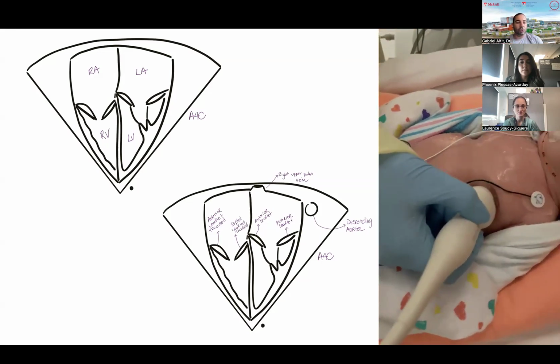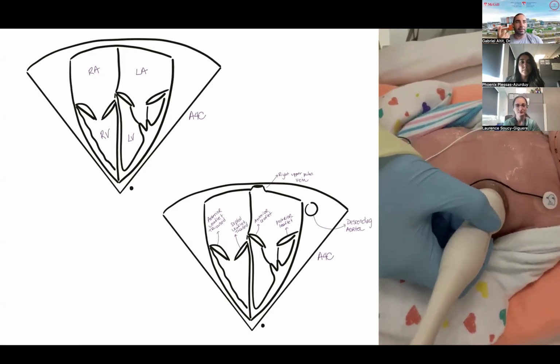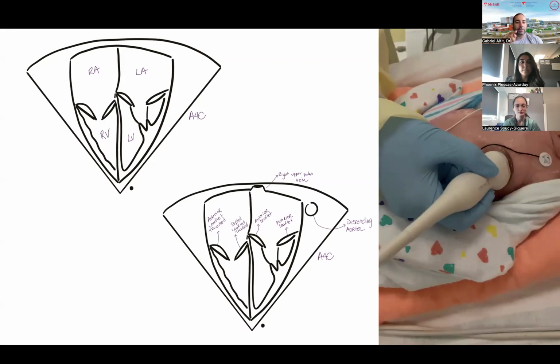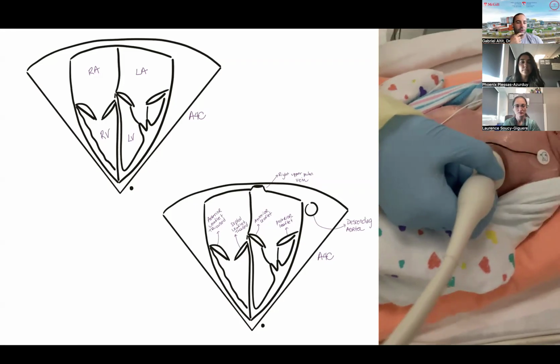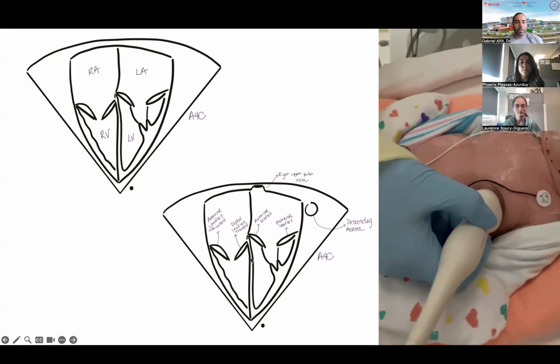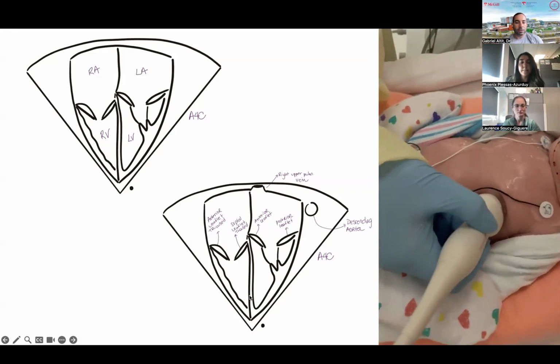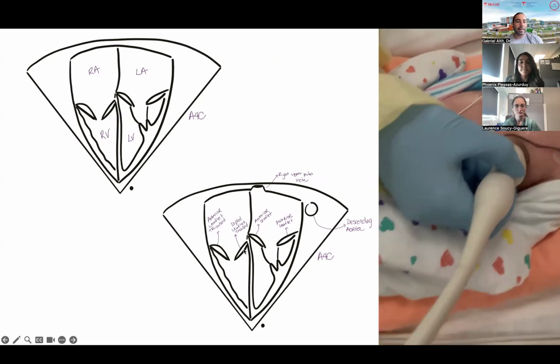Even if there's emerging literature looking at the FAC in the three-chamber view, it's probably not as pronounced in terms of an FAC and contractile power as in this particular view, where you really have the most muscular portion of the right ventricle body. And then you get to see a lot of the muscular trabecular portion of the septum, and you get a portion here of the septum that we typically call the inlet septum.